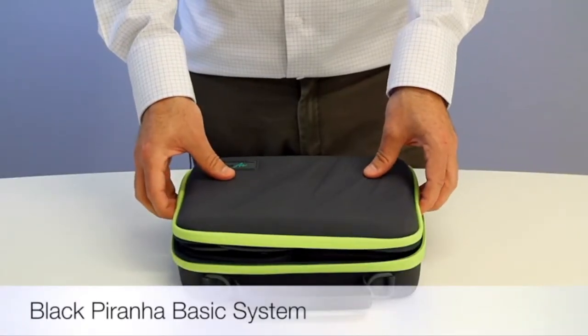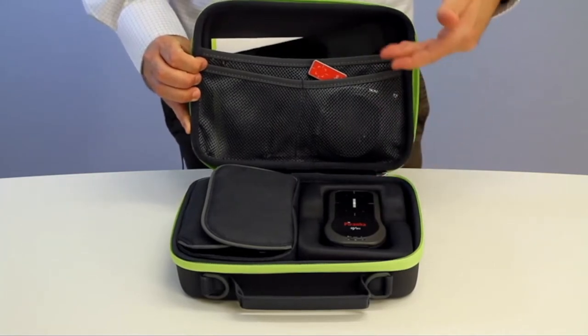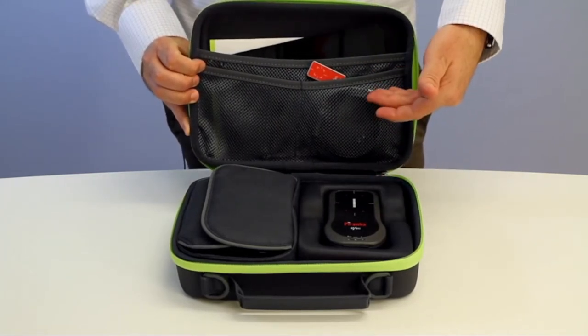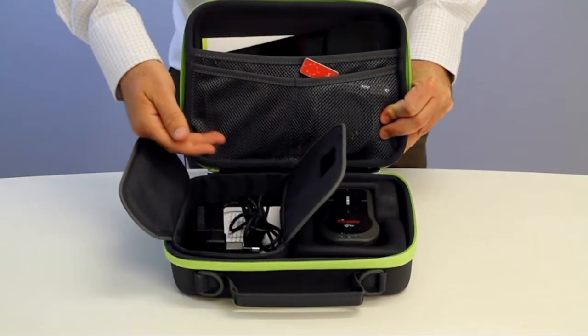The basic system comes in the RTI Softshell case and contains the Black Piranha, a tablet and an RTI dose probe. There is also the power supplies, cables and manuals that you will require.